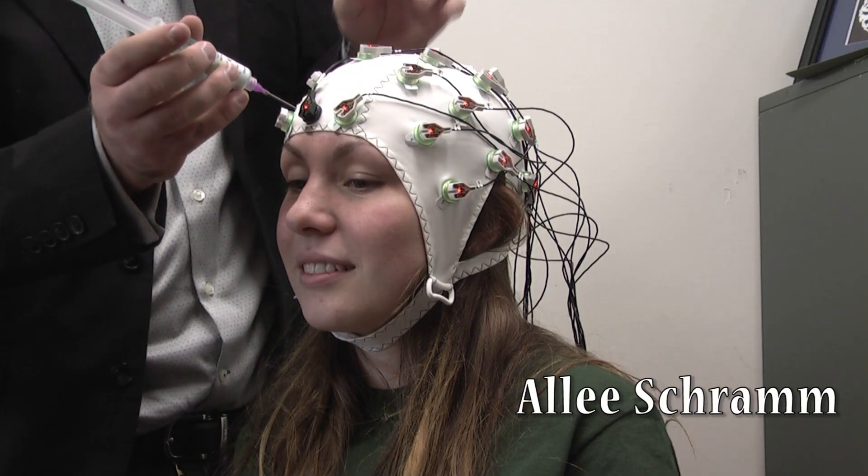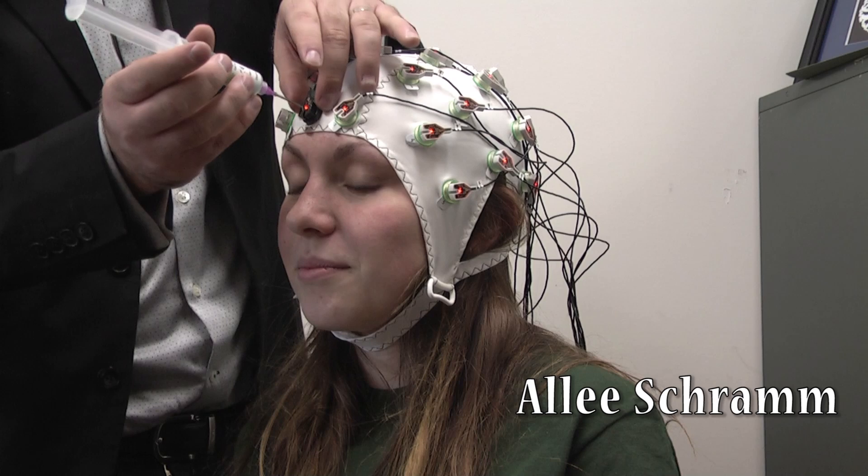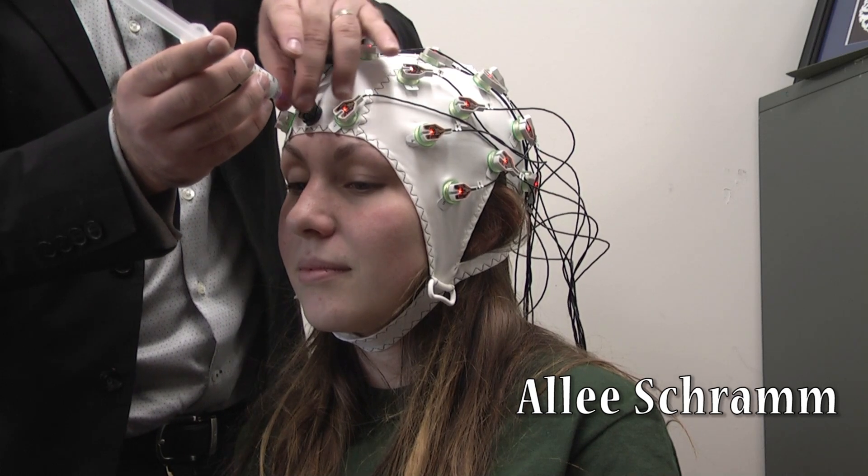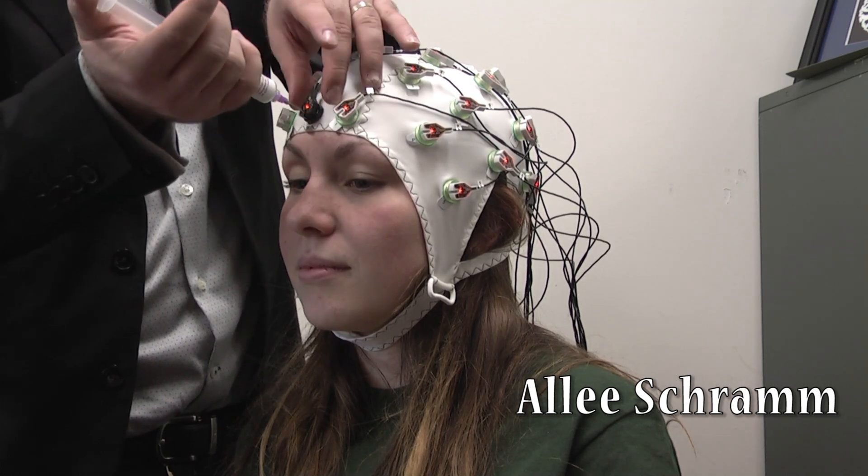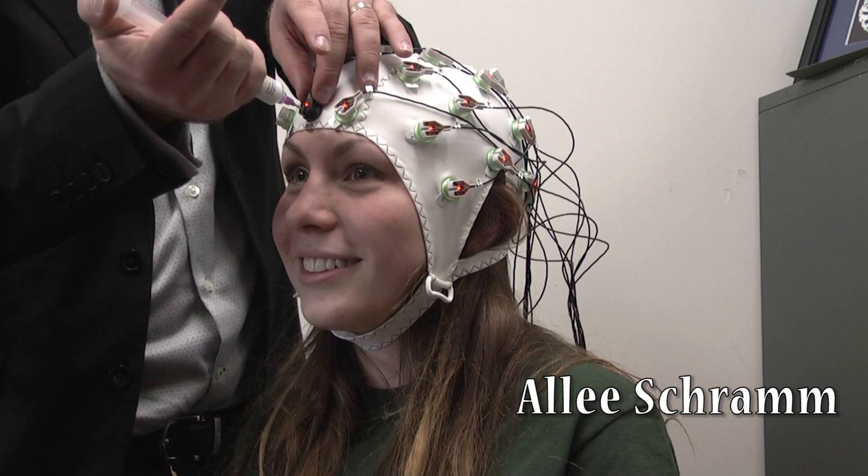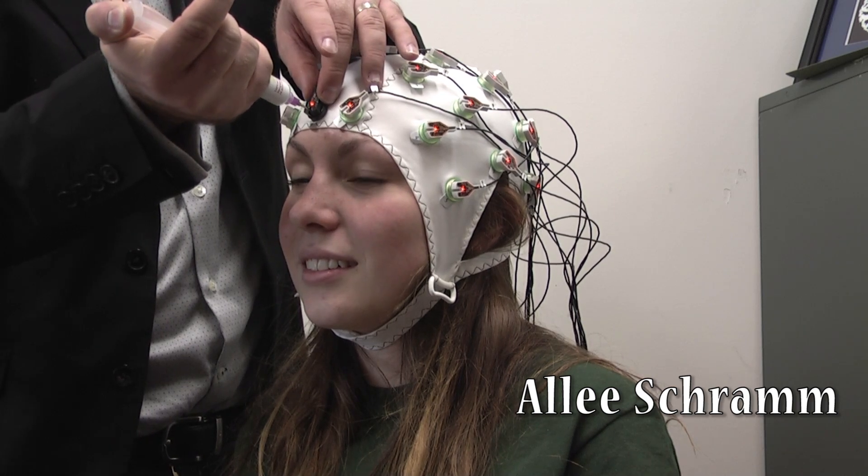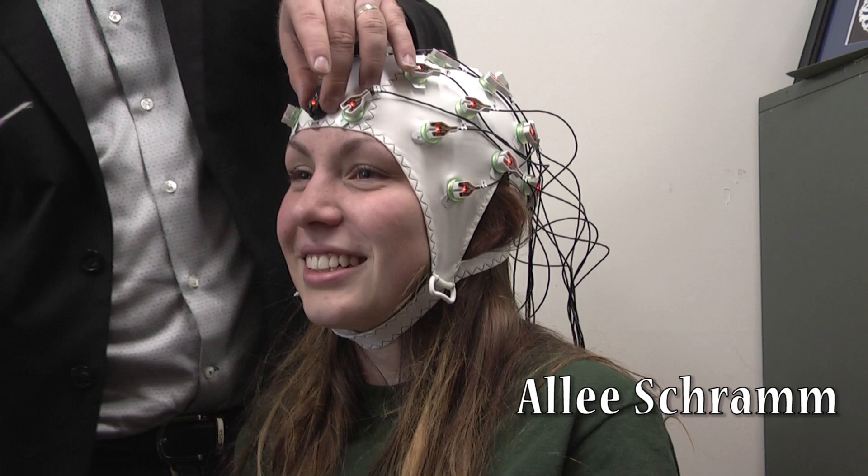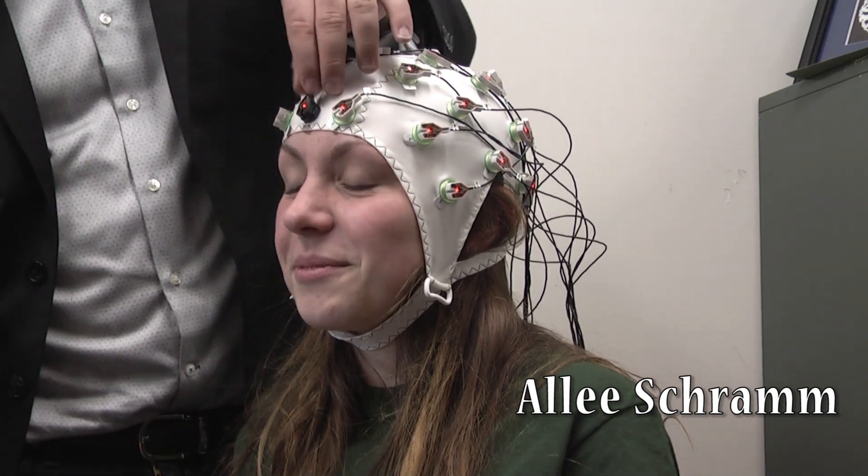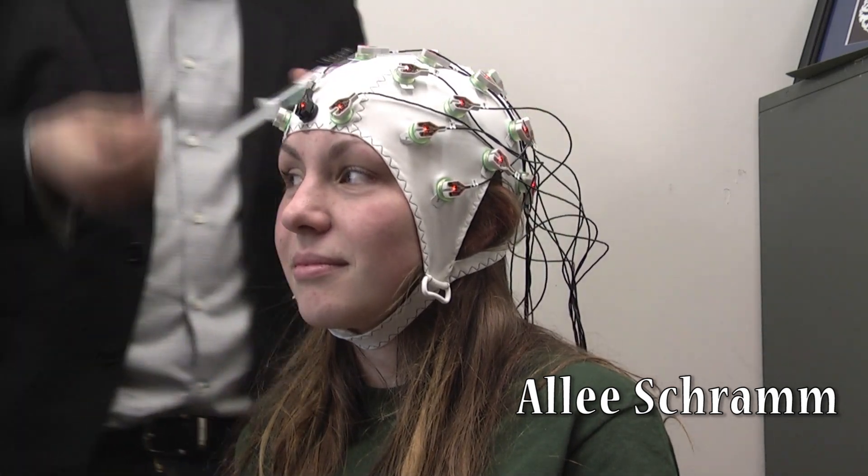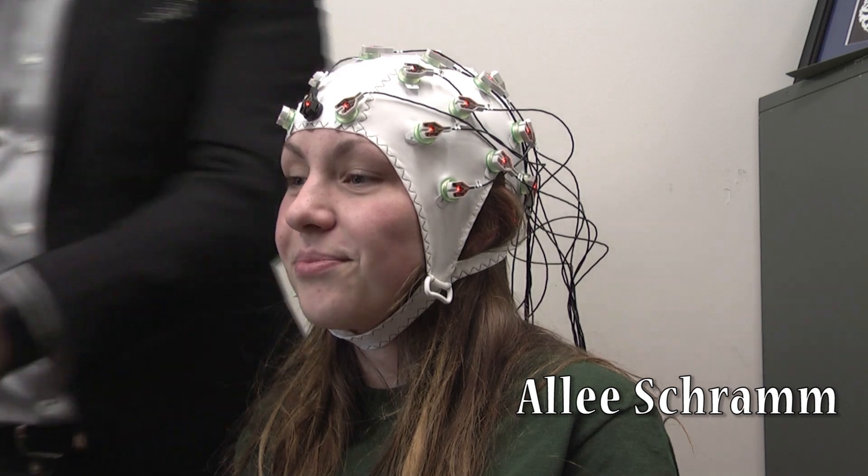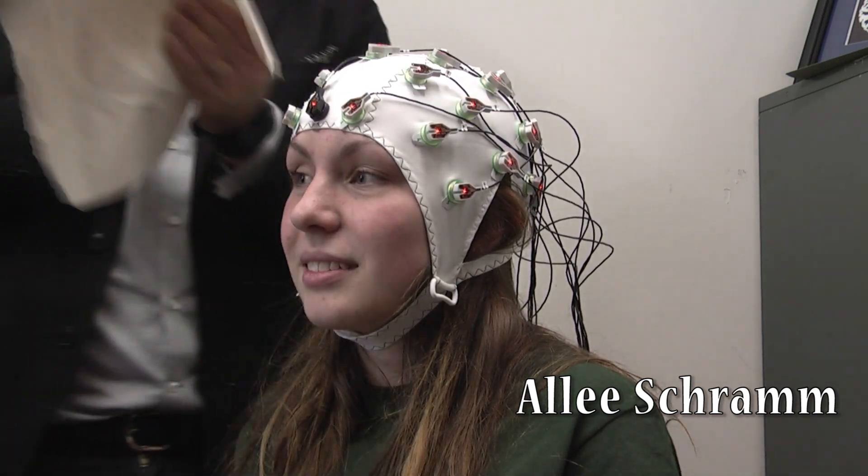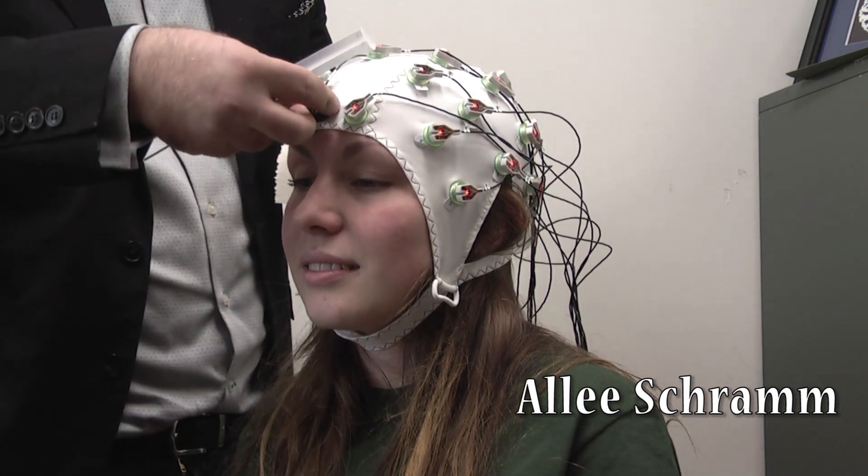As I go into a little slot that's in the top of each of these amplifiers, I go in with a flat tipped needle that no one can feel. Can you feel that at all? No. Good. Now you're going to feel something. Yep. And I drop a little bit of gel in. I'm going to wiggle it around, and I'm going to give it a second to get to where it needs to be, because the gel will start to set, and it will start to form a connection between that specific electrode.